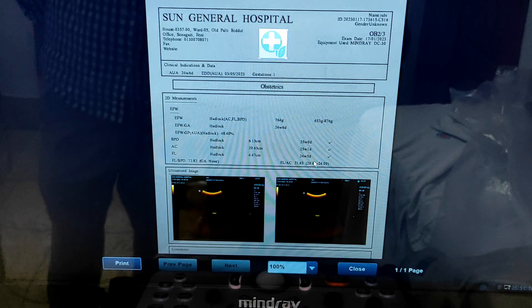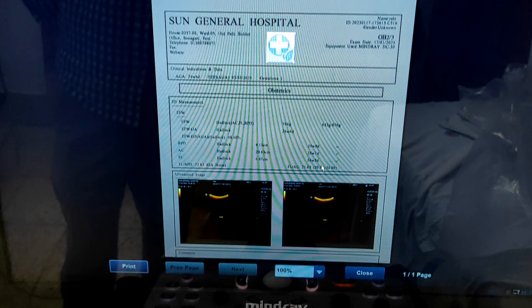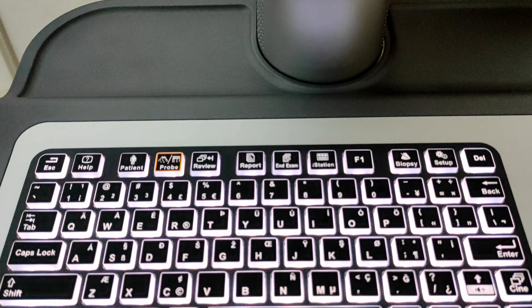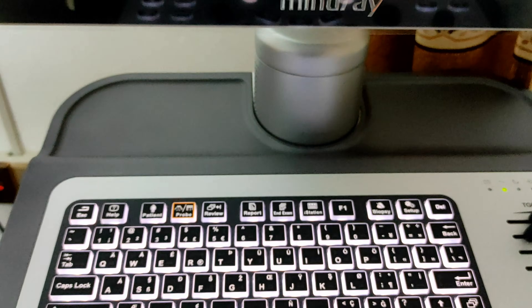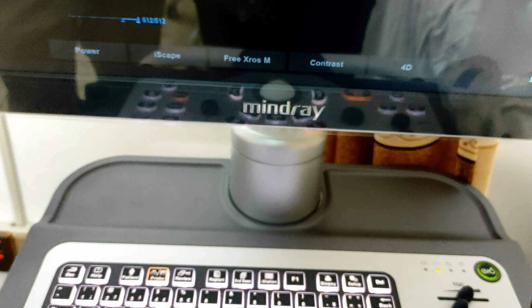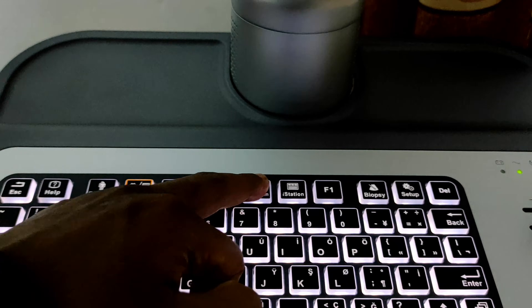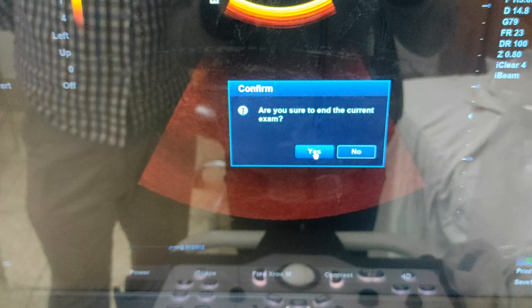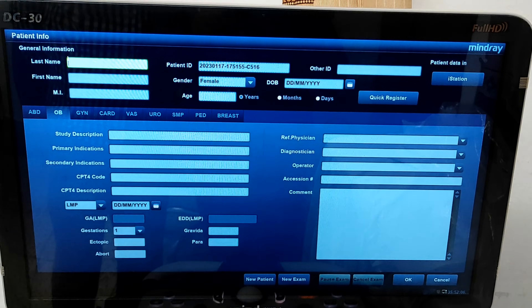If you want to input new patient information or to end your exam, first press the freeze button, then press end exam. Click yes — that means our examination is over for that patient. Now we can input another patient's information.